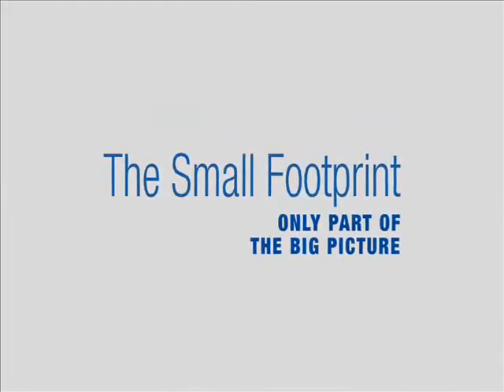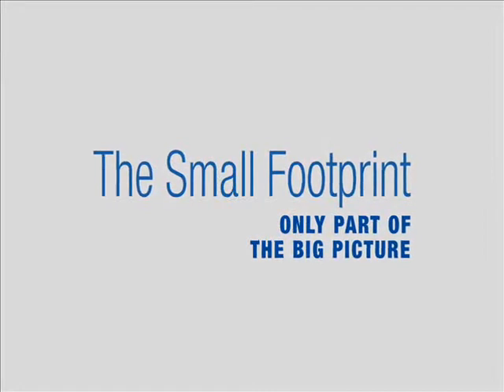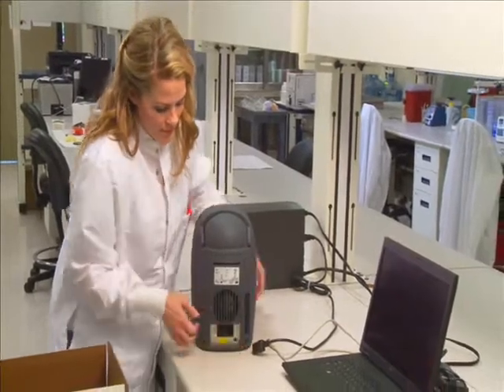With an extremely small footprint of just 12 by 8 inches, the Integrated Cycler requires minimal space in the lab. With a weight of just 17 pounds, it's easy to pick up and relocate whenever the need arises.